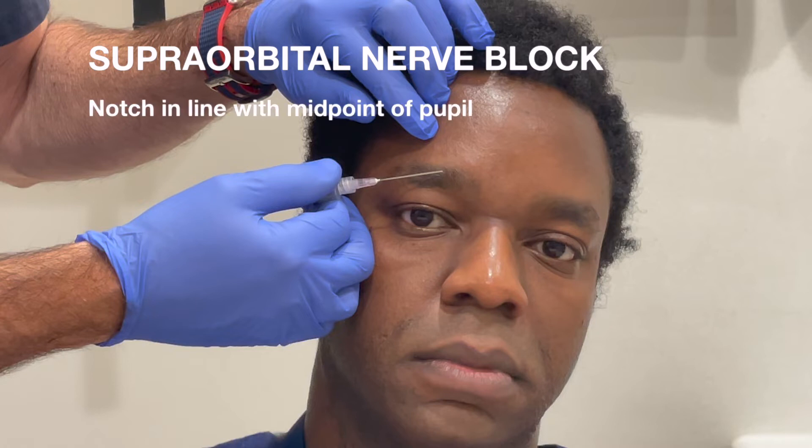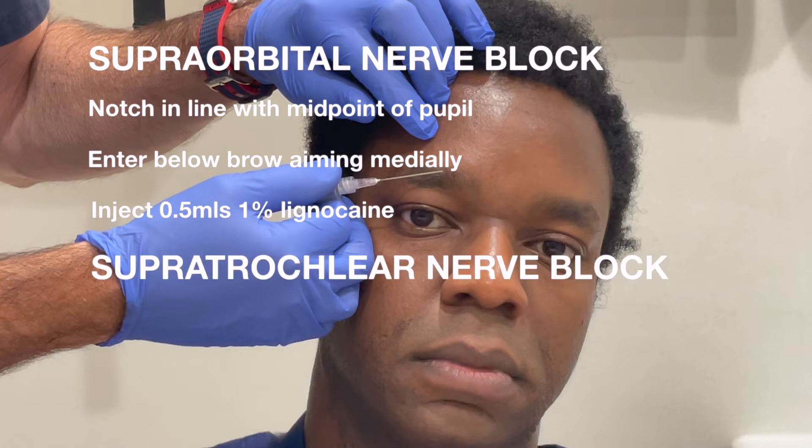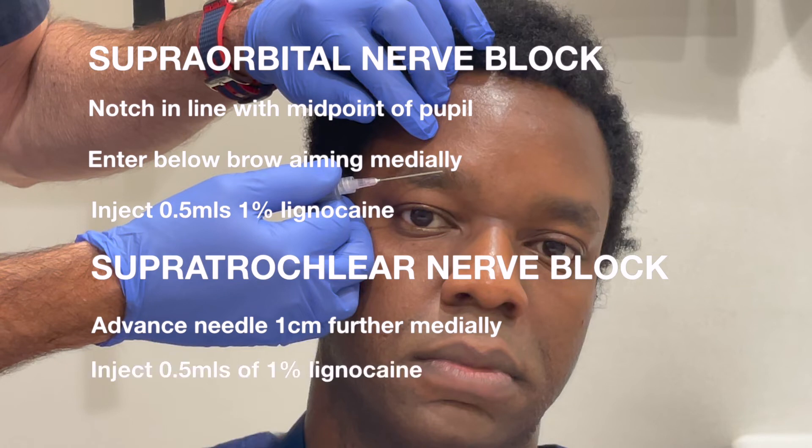Supraorbital nerve block summary: Palpate the supraorbital notch, which is in line with the midpoint of the pupil. Enter below the brow aiming medially. Inject half to 1 mil of 1% lignocaine. You can extend this to a supratrochlear nerve block by advancing the needle one centimetre further medially — again inject 0.5 to 1 mil of 1% lignocaine to complete the block.